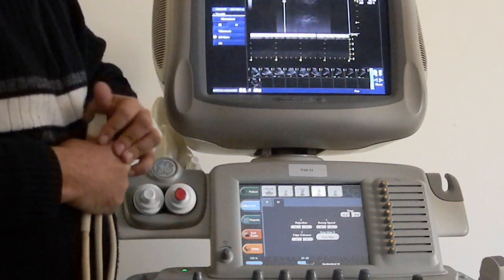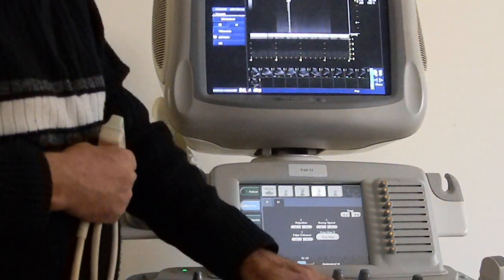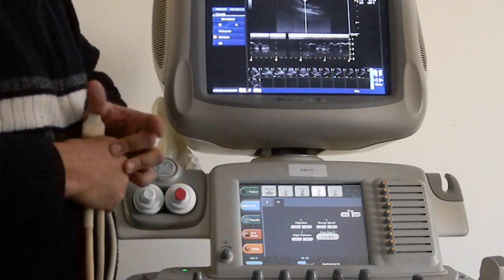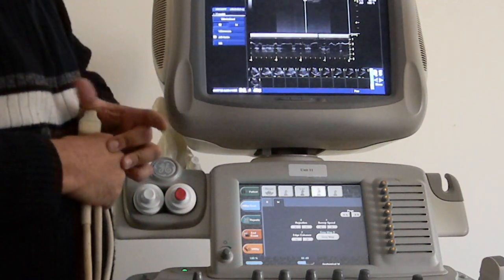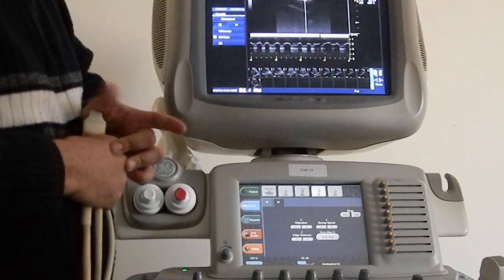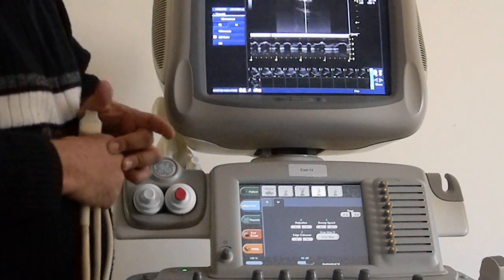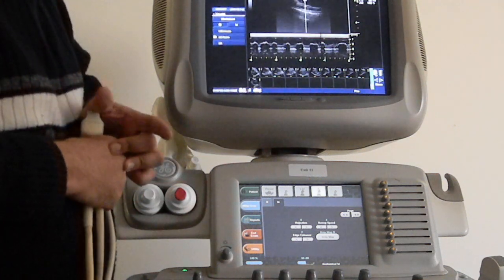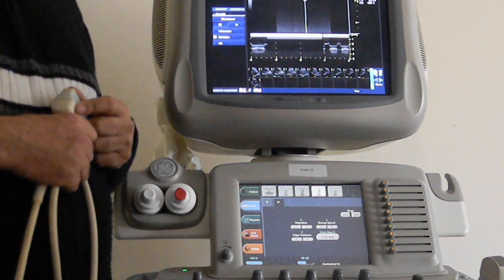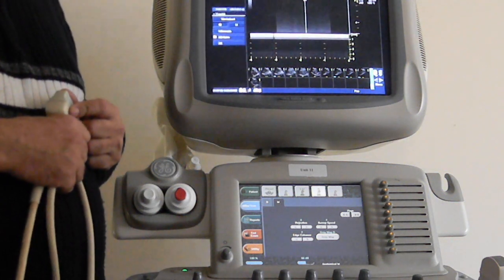Oh, that's cool. Okay, so we can see. Oh yeah, look at that. So what do you see right now? That graph there at the bottom is made from just the movement recorded along this line here. Clear? Okay.